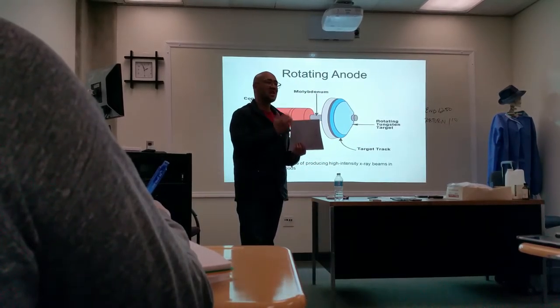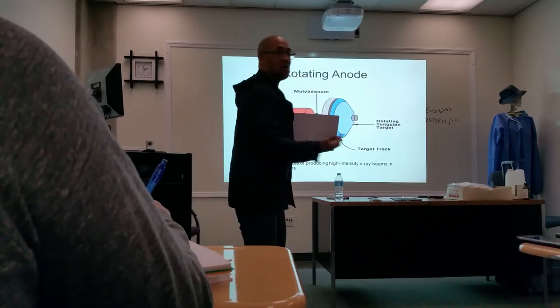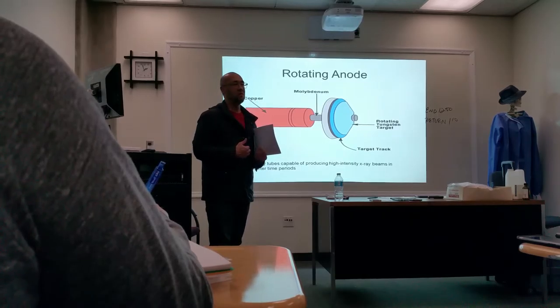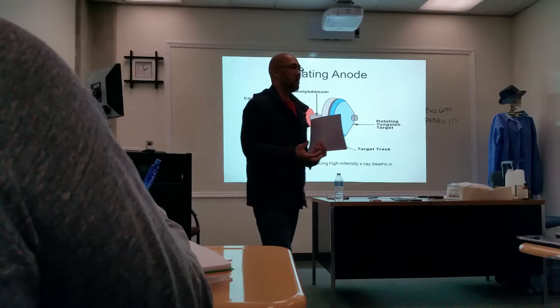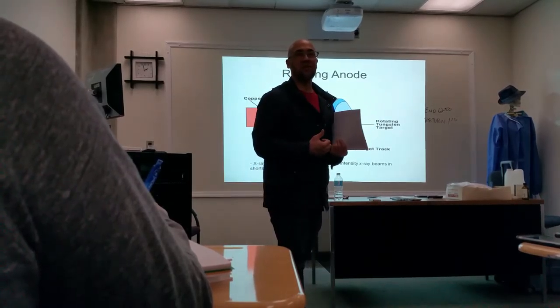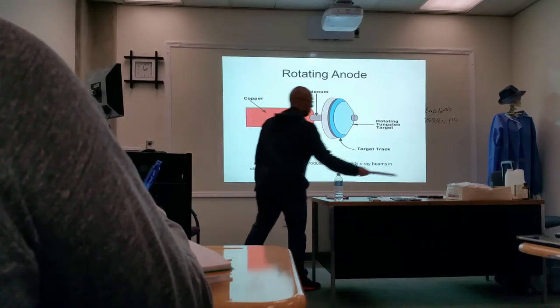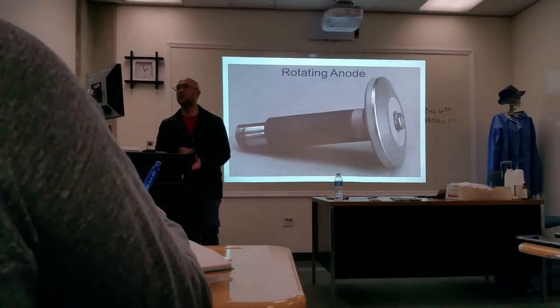So that's the advantage, that the same spot doesn't get hit continuously. The spinning allows the disc to cool off. Therefore, you can use higher energies and X-ray production is more efficient. Okay, it looks something like this.